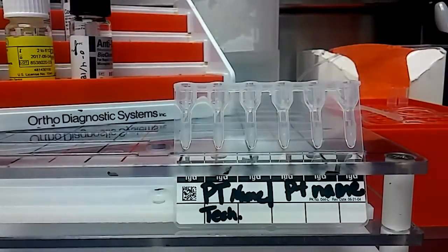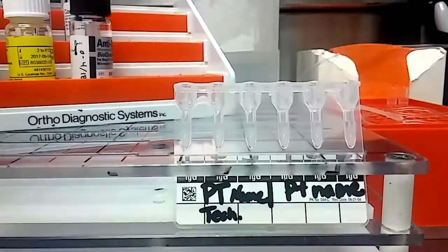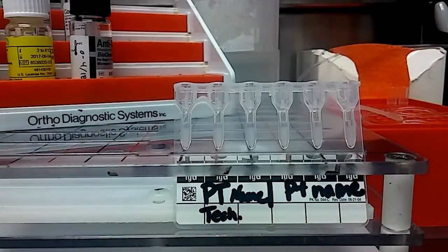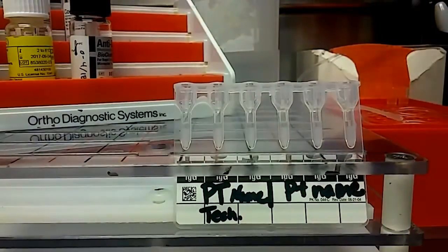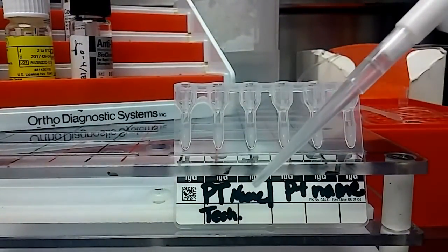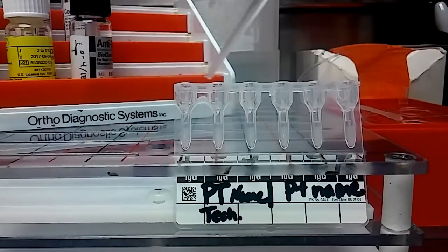Once that's in there, I will add the plasma. I'm using Confidence for our other QC material, and this is serum. Here's what it looks like. New pipette tip — new one every time, don't want overlap. Prime it once.